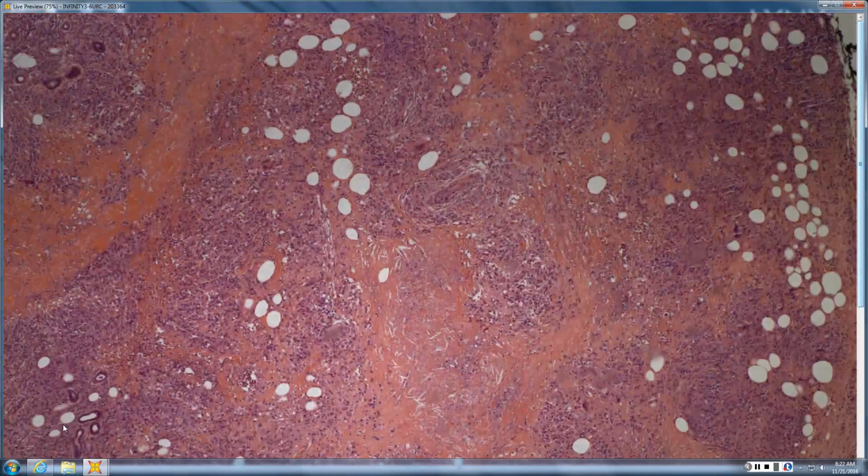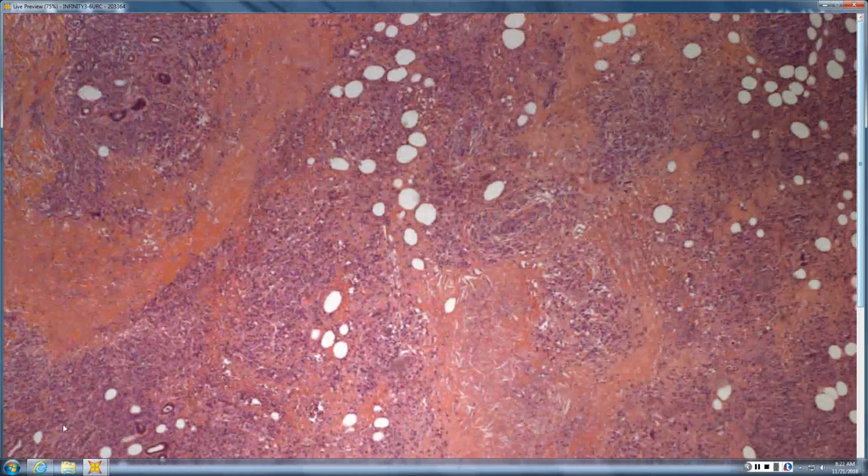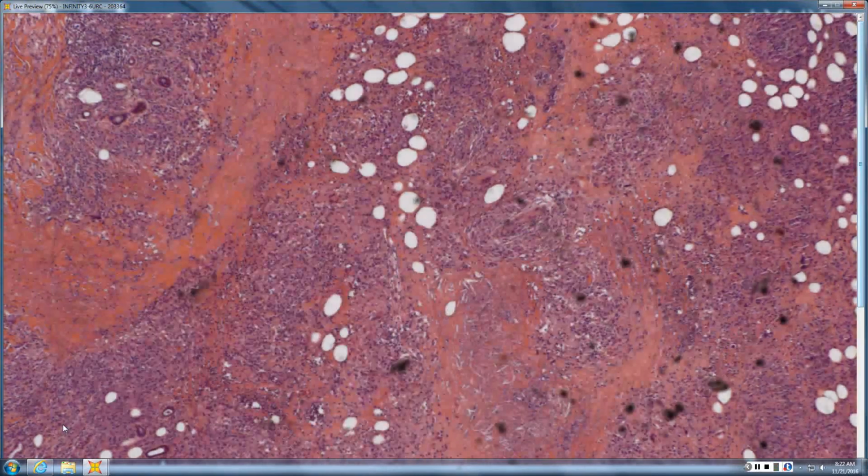Oh, I'm sorry. I wasn't exactly sure. You have some granulomatous changes deep in the dermis. There were some areas where there were clefts that I was wondering if it was silica or something like that. Or cholesterol, right, when they're needle-like clefts. Yeah.